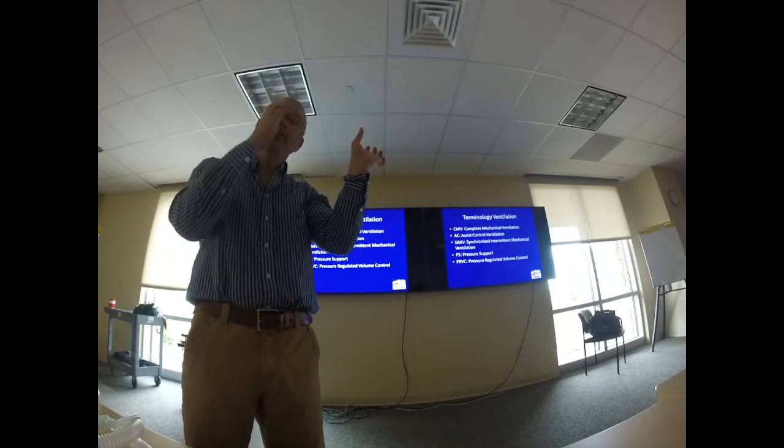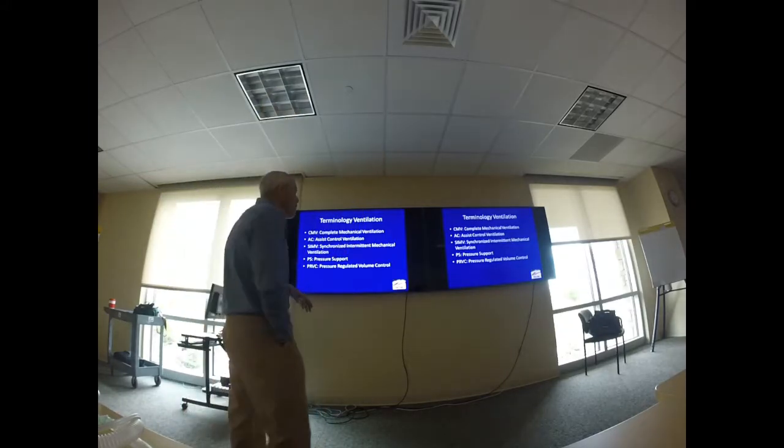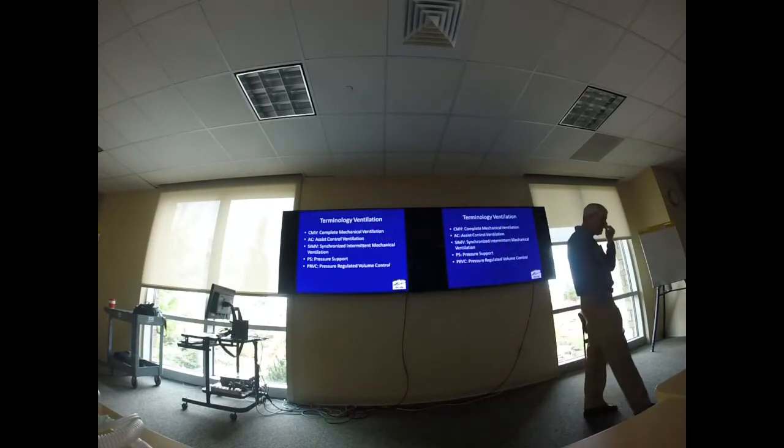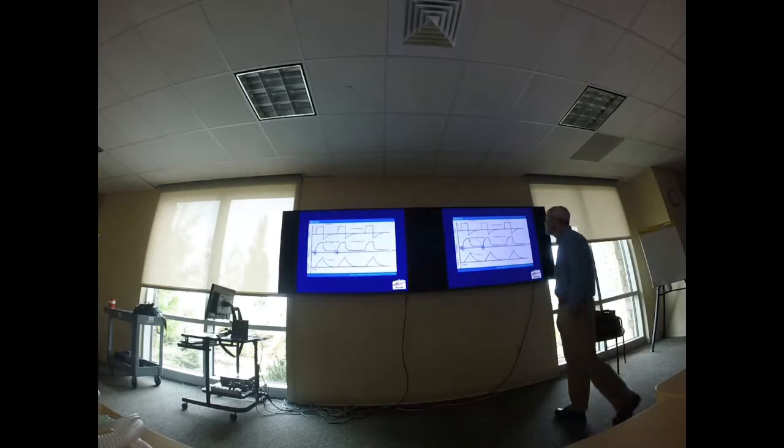So it's going to regulate it is what it's going to do. So hopefully I'm able to do kind of the best of both worlds with pressure and volume with PRVC, but it regulates it for me. And I'll show you guys some pictures here, which will hopefully help you make sense of it a little bit.